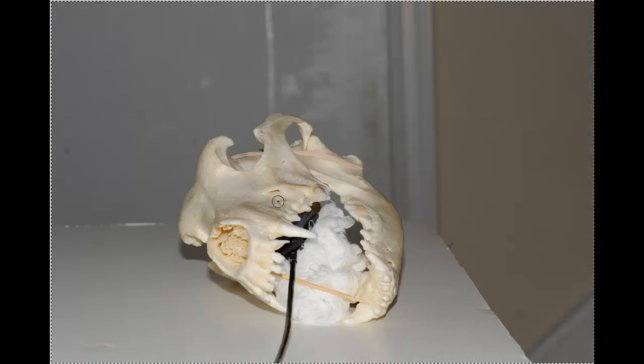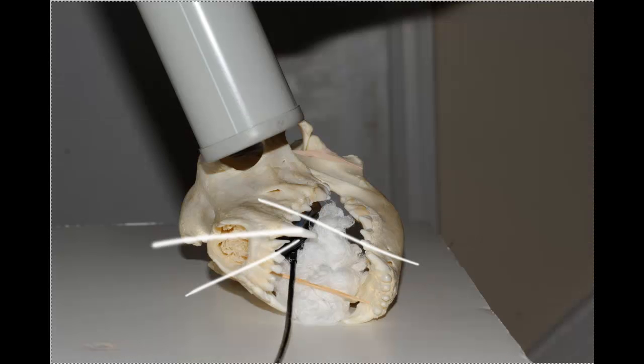Moving the sensor forward, the angles don't really change much. We still have the teeth at about that angle, the sensor about like so, and halfway between, something like that. So here we might be looking fairly close to the bisect. I'm a little bit off on that one, as you can see. I'm actually looking more at the sensor there.